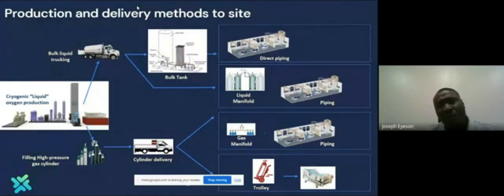So basically, this is how you produce liquid oxygen from the plant and then send it to the site and then to the patient.